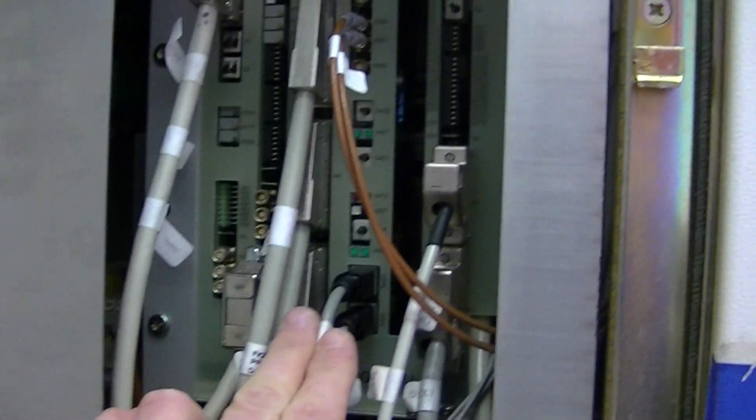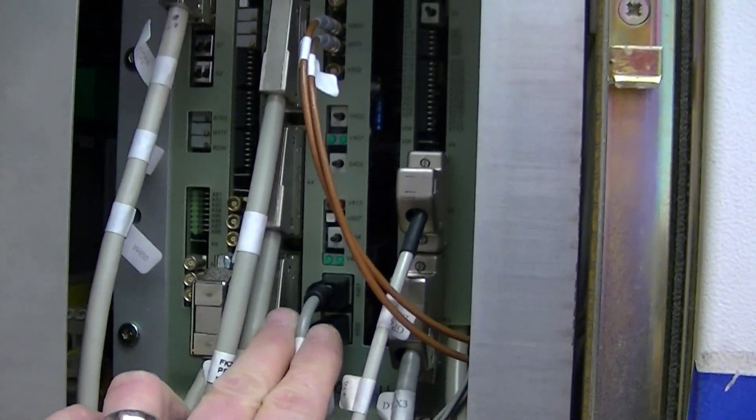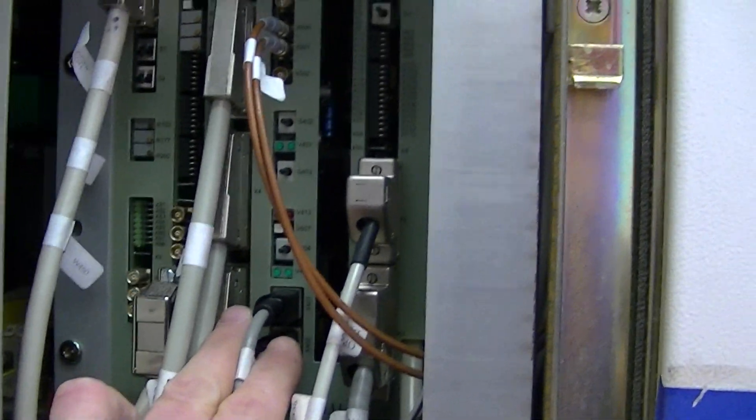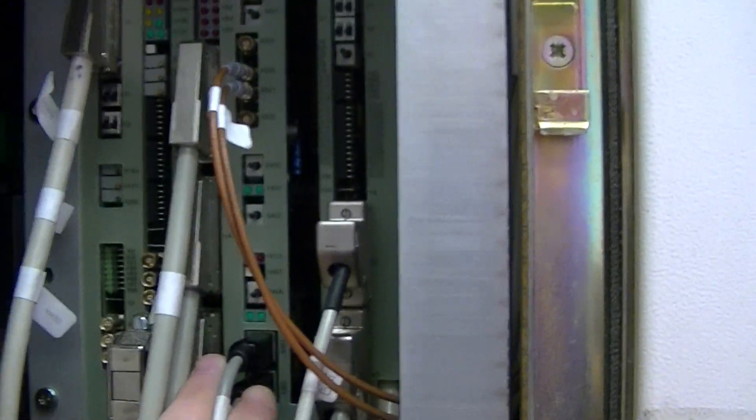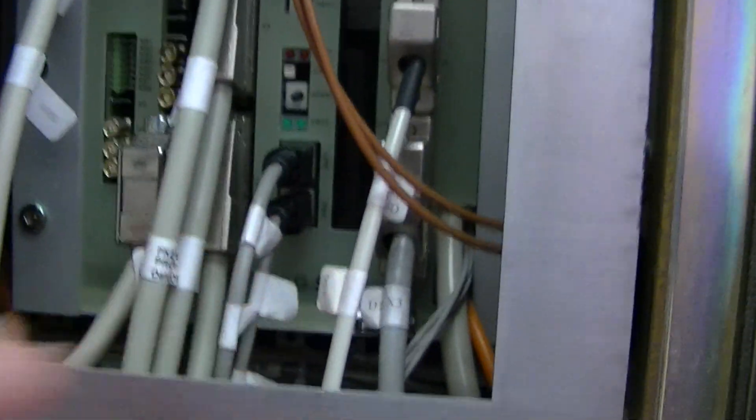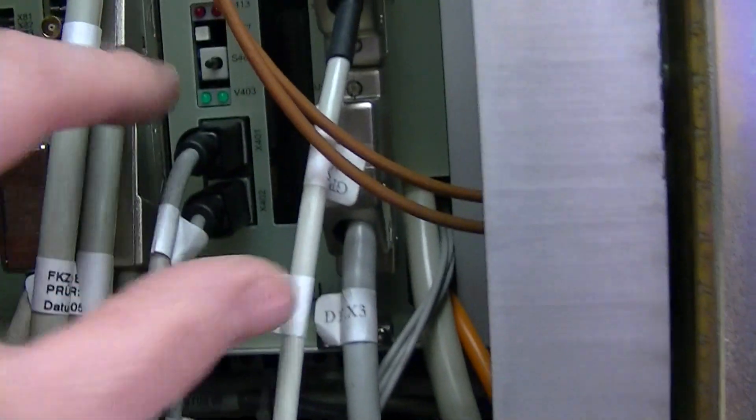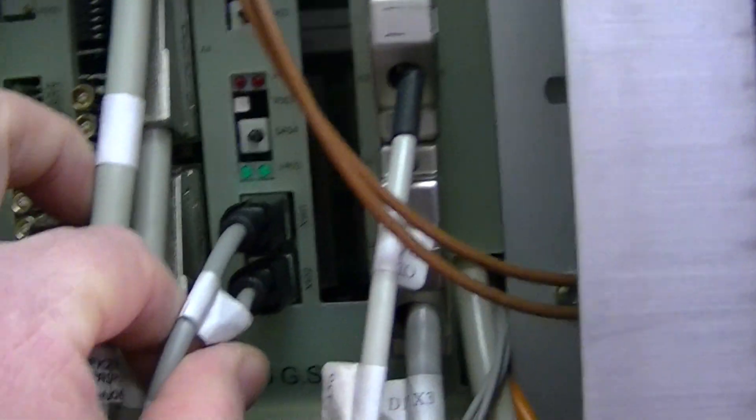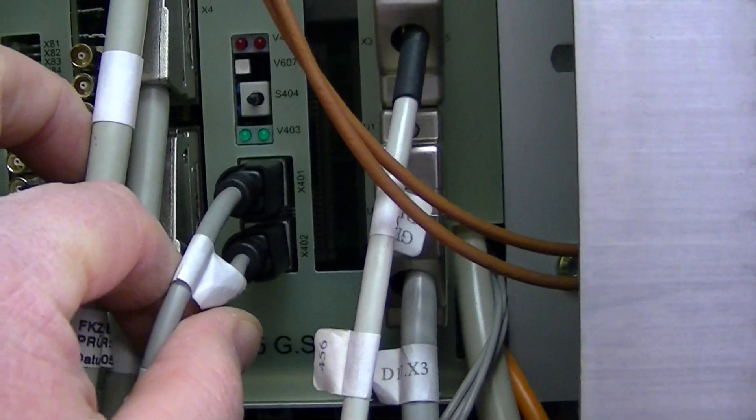One board over to the left of that, this is the D16 board. This is what talks to the CAN bus. This is a mechanical CAN bus connection.